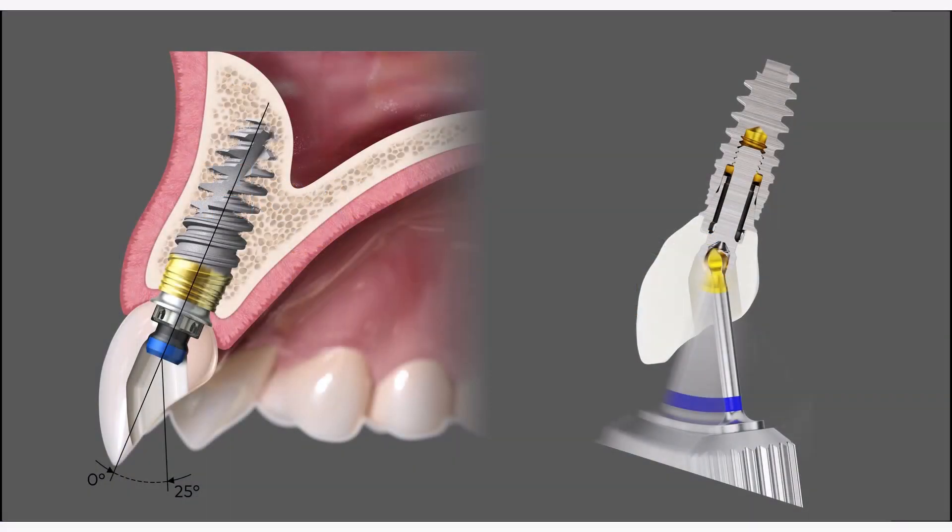In this video, you will learn how to design a Novo Procera Full Contour Zirconia Screw Retained Crown with Angulated Screw Channel.